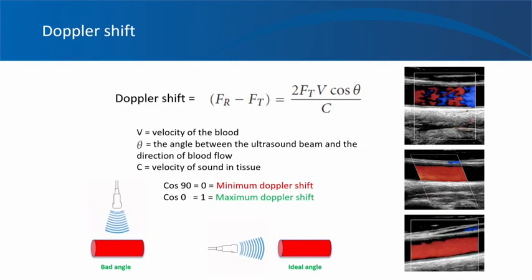So the first picture, the vessel runs perpendicular to the color box here. Therefore, the Doppler shift is poor, like you are seeing some faint signals. The color box is the area where evaluation of the flow is performed, this one, and it also tells the direction of the beam. And you can steer this color box in different directions.